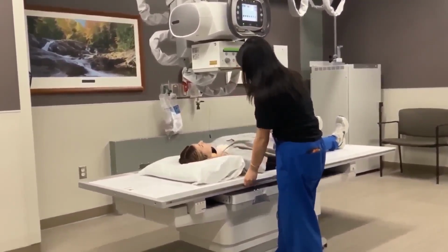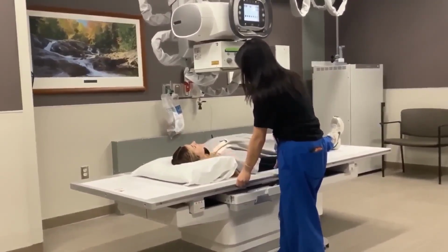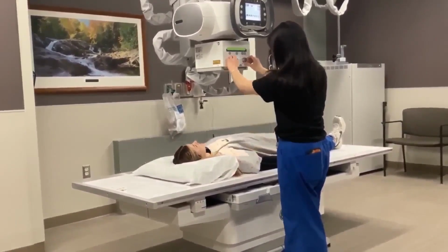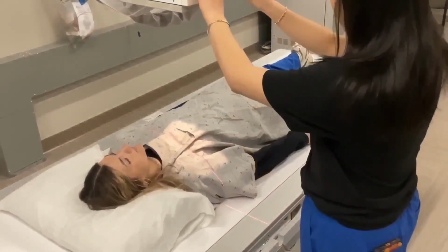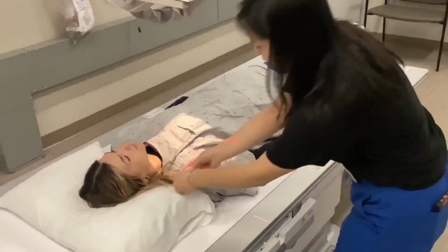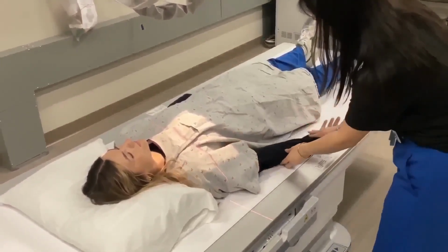The central ray is perpendicular, centered 1 inch inferior to the coracoid process. Ensure that you're collimating to include the proximal humerus and the scapulohumeral joint. The arm is externally rotated so the epicondyles are parallel to the IR, placing the humeral head parallel to the detector.